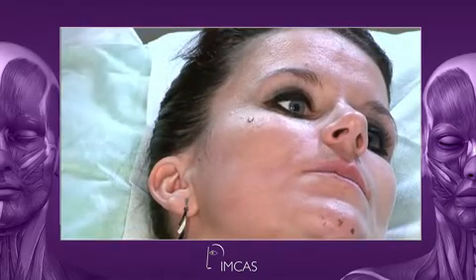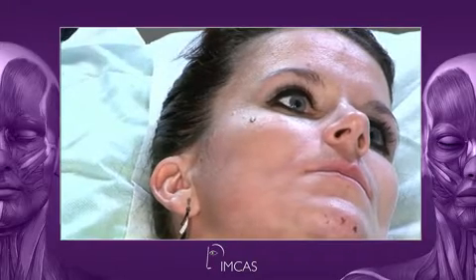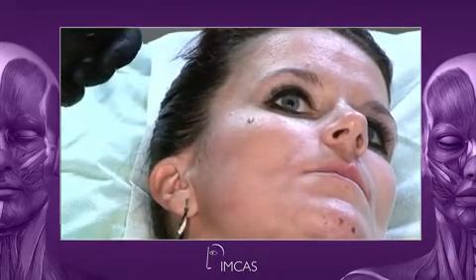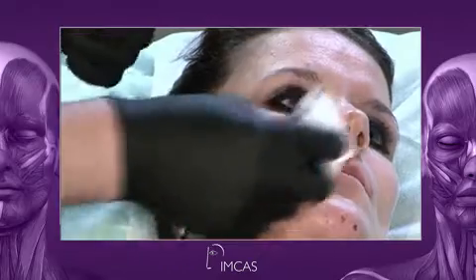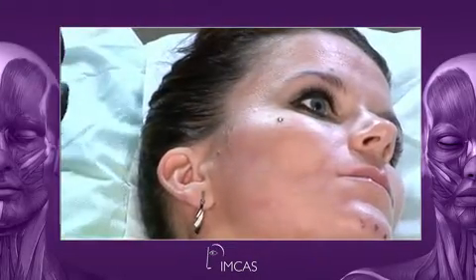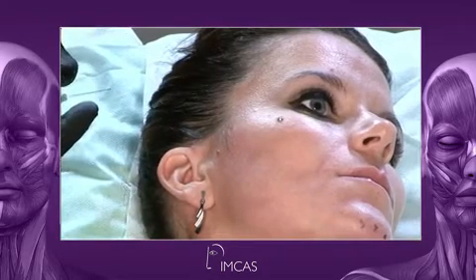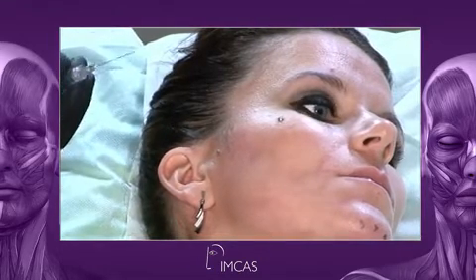I had a question before about anesthesia. This patient has no anesthesia prior to the treatment. In my opinion, creams are mostly quite good psychologically for the patient, but since we have fillers with lidocaine inside, we can use that to numb the lip.